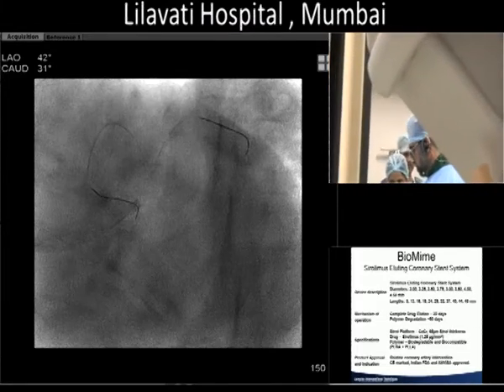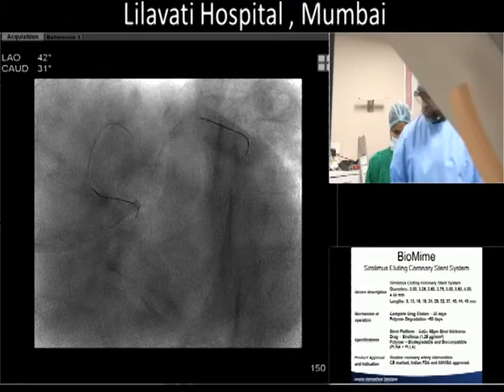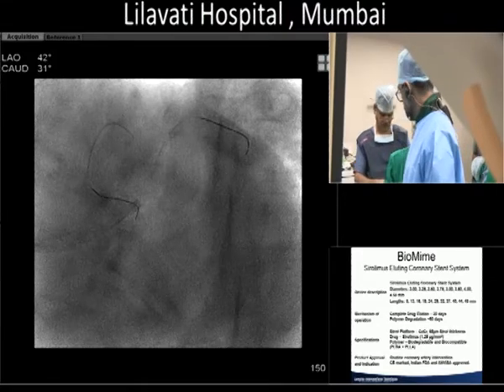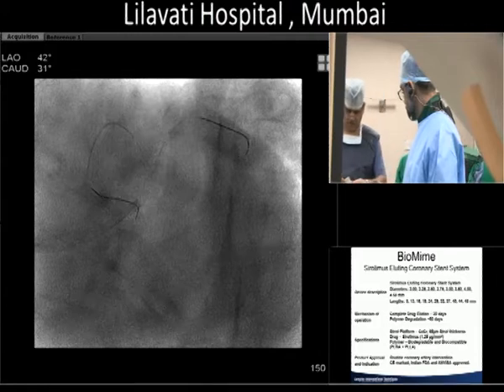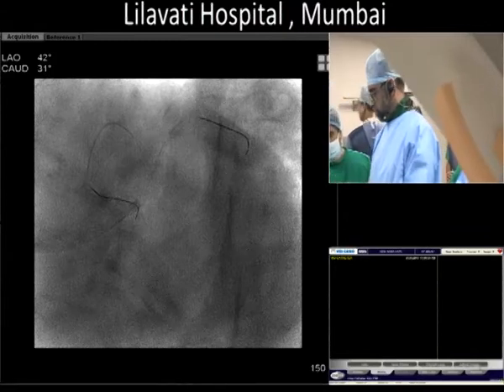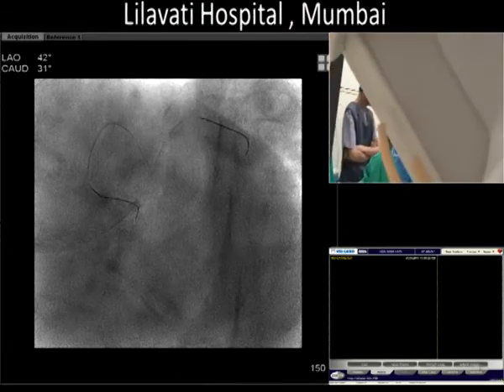So he's putting a 2.25 stent in to make sure there's no outflow dissections. He's going to expand that first diagonal stent with a 2.5 non-compliant mosaic. We have both mosaics in the United States, both compliant and non-compliant, and what we like about it is not only the different lengths, which I love, the long lengths, but also very deliverable and very reshapeable, especially in our CTO cases.